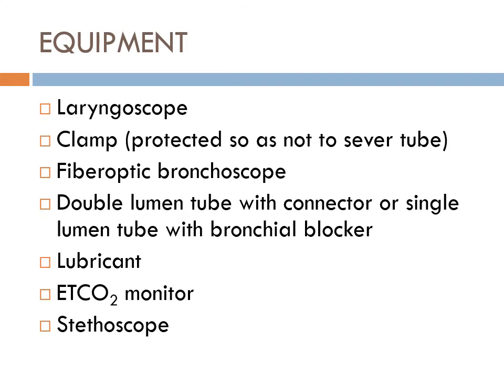Because I could ask a question where it's an obvious answer, but it's like a weird question, and I'm sort of like, how many cc's would you inflate the blue cuff in this situation? 0, 1, 2, 3, or 4. You'd be like, well, normally I inflate around 1.5 cc's, maybe 2, enough to cause an occlusion. So you'd say 2, not 0. See, I'm misleading you. I'm leading you down the wrong path.